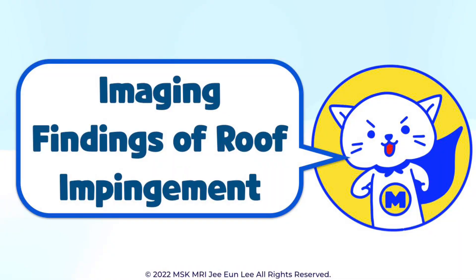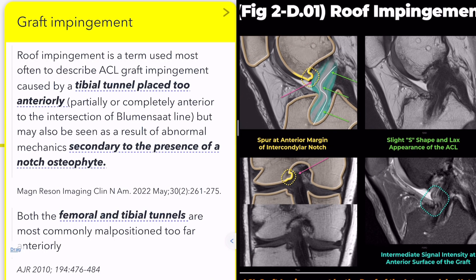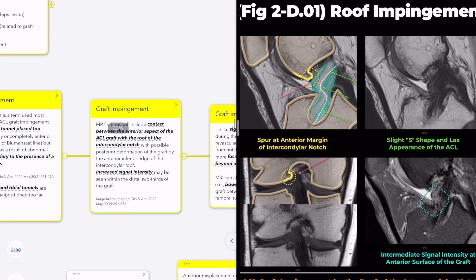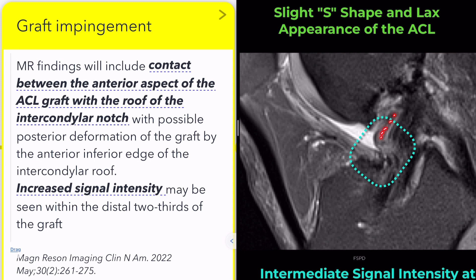Imaging findings for roof impingement include contact between the anterior ACL graft and intercondylar roof, with possible posterior bowing of the graft. Increased signal intensity is seen, especially within the distal two-thirds of the graft. With persistent impingement, the ACL graft may eventually tear.